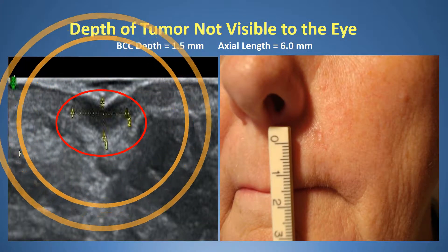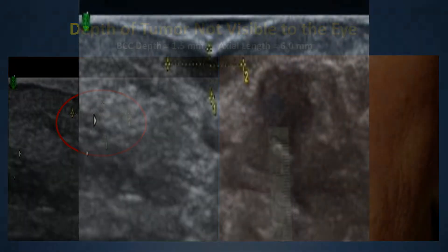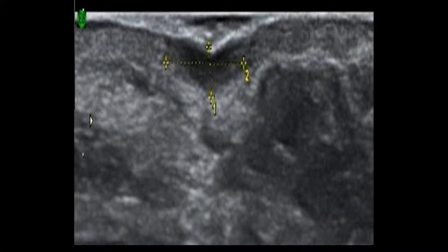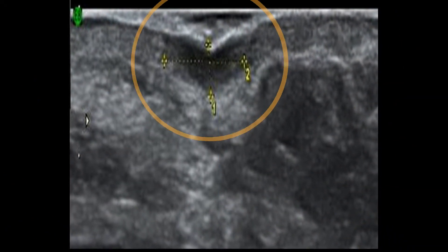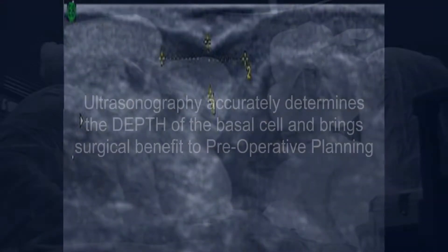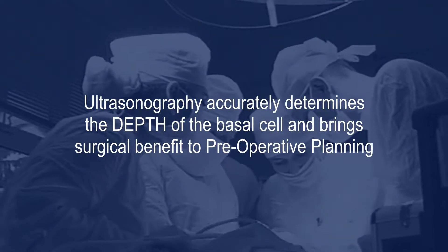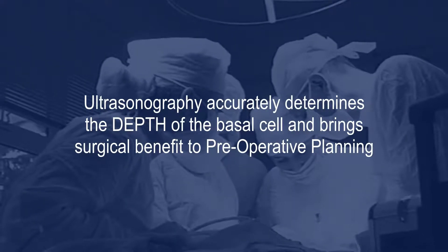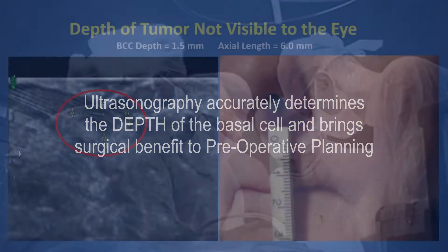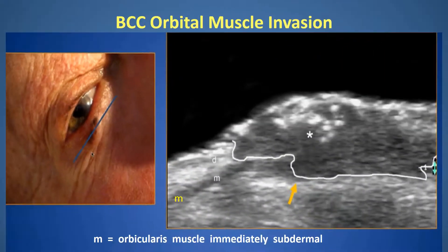Here, we can identify the tumor as black under ultrasound. The important thing about this basal cell is that you can see the depth, which makes the difference between a 5-minute excision or a 5-hour Mohs surgery. This helps the surgeon preoperatively to determine how deep the tumor is, and also sometimes even how aggressive it is. We can see both the depth and the aggression in this view.